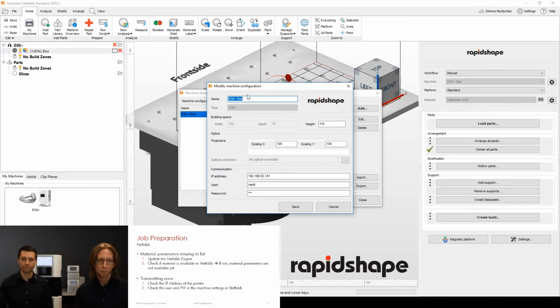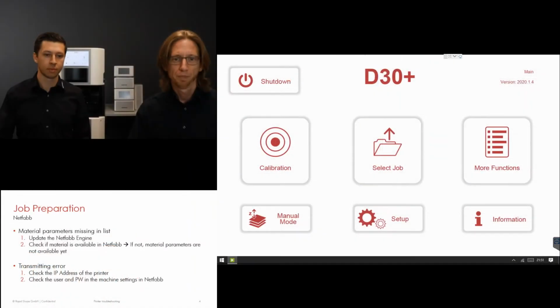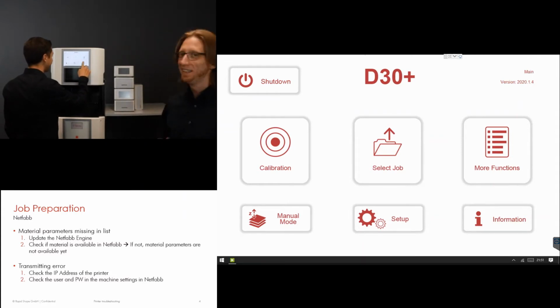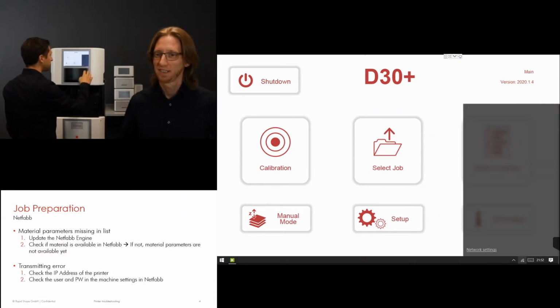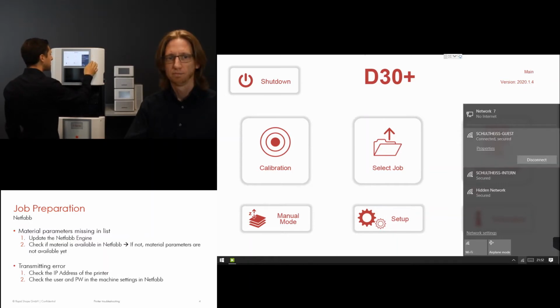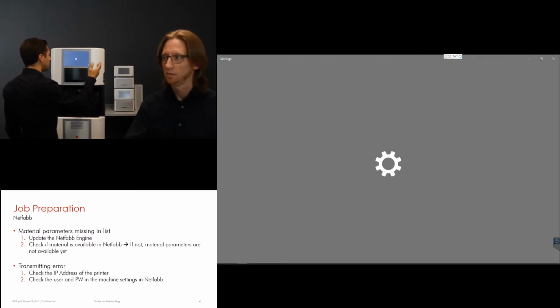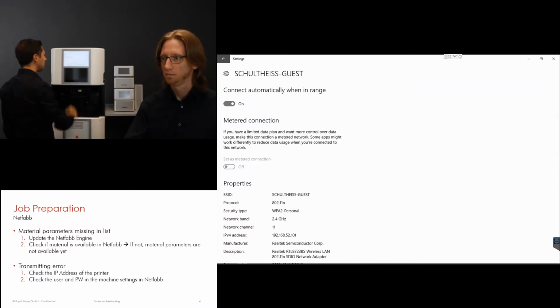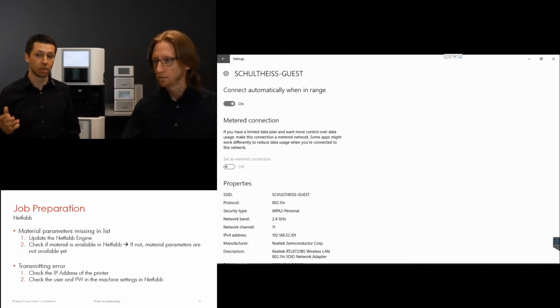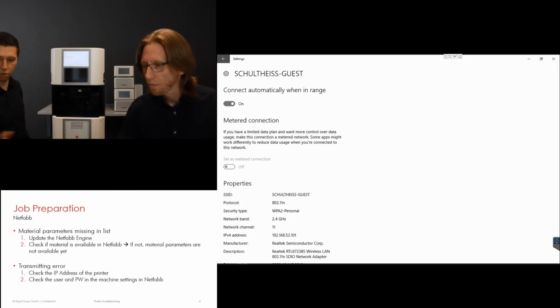All right, let me share the screen with you guys so that you can see what's actually happening here. This is the machine screen, and Robin will show us where to find the IP address on the machine here. We are now connected with Wi-Fi, so it's a bit more complicated, but also quite easy. So I will just select the Wi-Fi I'm connected to and click on properties, so I can see it on the bottom left. Now the IP version 4 address, and I can compare this one directly with the one I put in NetFab. So, it seems to be, you said it's a 101, 52, yeah, 101?